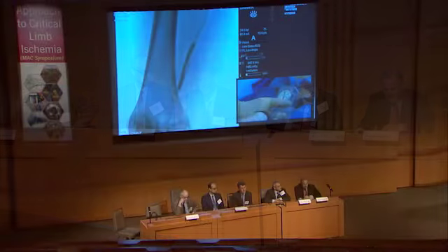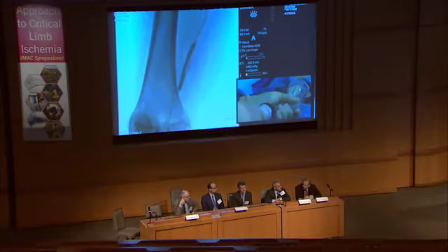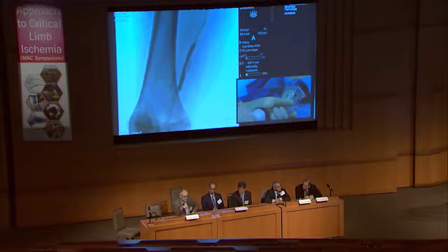Yeah. Okay, give me that Supera. I'm going to go with the 120 Supera then. Hold on one second. Let me see. Yeah, okay. Or 150. Tom, would you treat the origin any different because it was a total occlusion and it had prior surgery and re-access may be difficult?